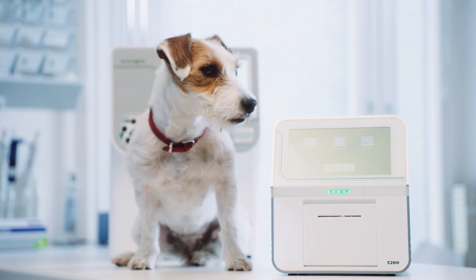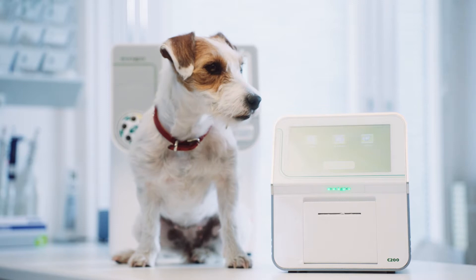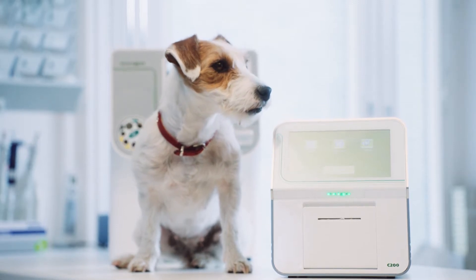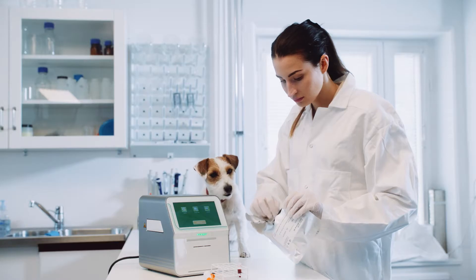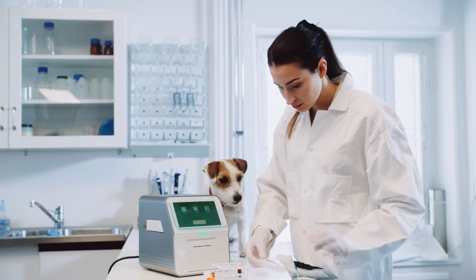The Exegos C200 is a small, simple, and easy to use veterinary chemistry analyzer for your laboratory. A 100 microliter sample is all that is needed for up to 17 parameters in one rotor analysis in less than 12 minutes.